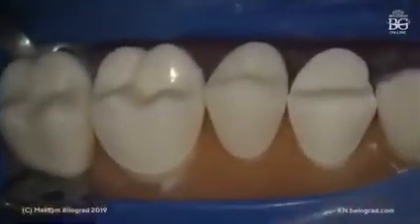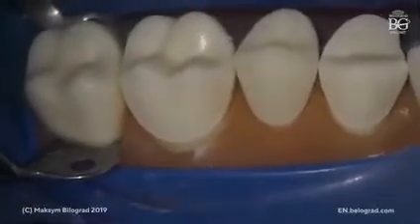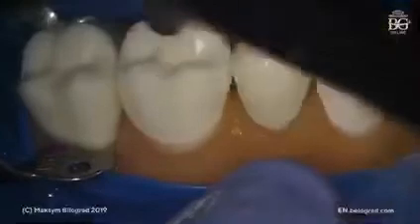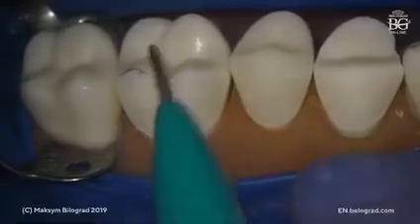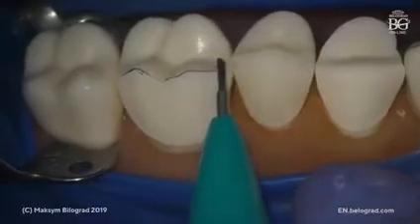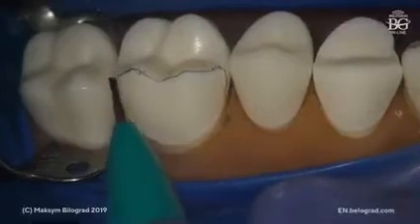Okay, let me just have this view for you to show all 3 different types of preparations. So step 1 or type 1 window prep. So here is our very final thing. I'm drawing this just to show you all these outlines, let's say.